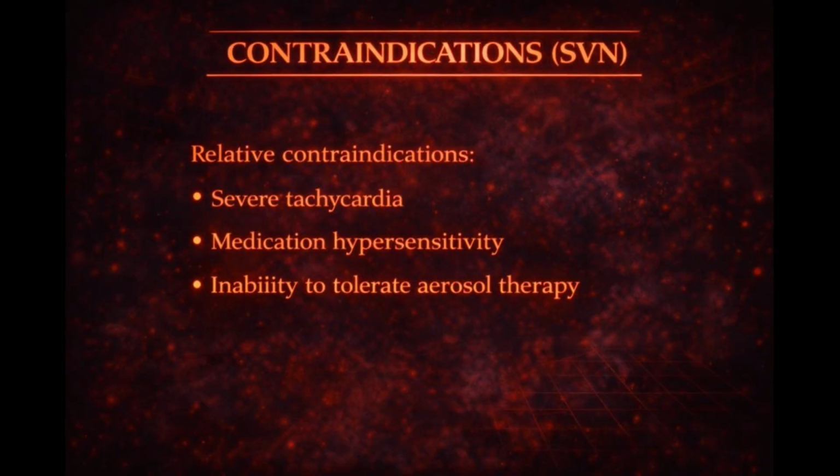Contraindications for SVN therapy are limited but include relative contraindications: severe tachycardia, medication hypersensitivity, and inability to tolerate aerosol therapy. These patients should be closely monitored during treatment. There are no absolute contraindications to SVN therapy. However, patients with these relative contraindications should be closely monitored.